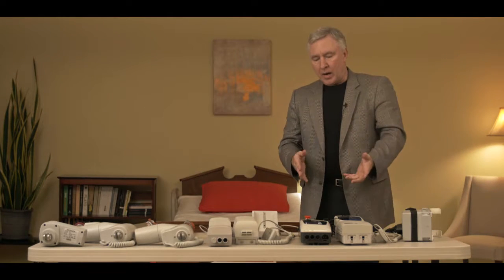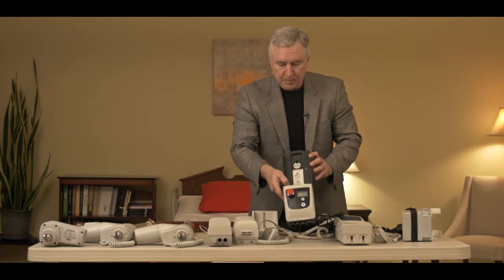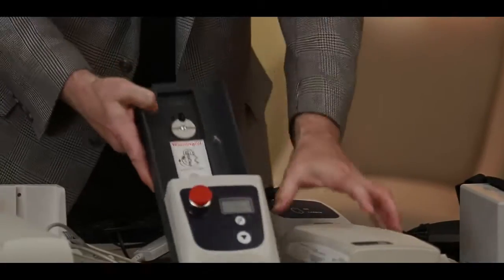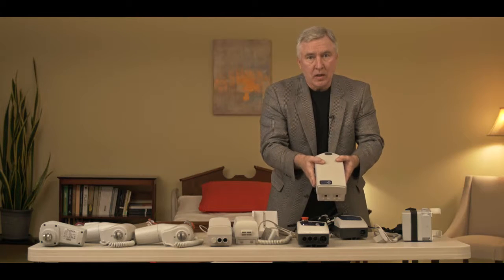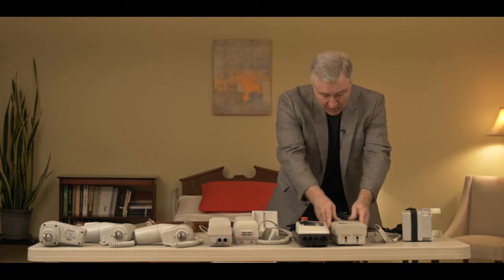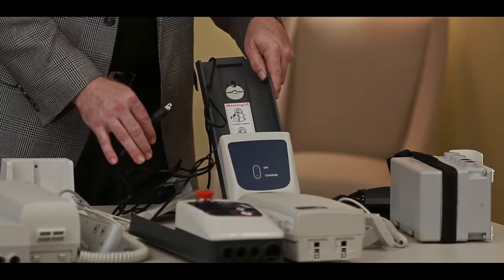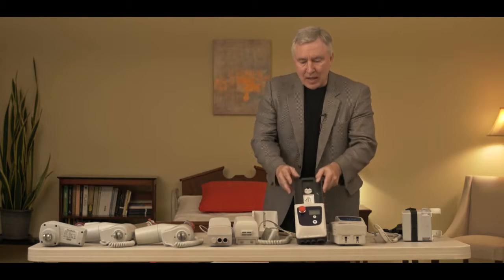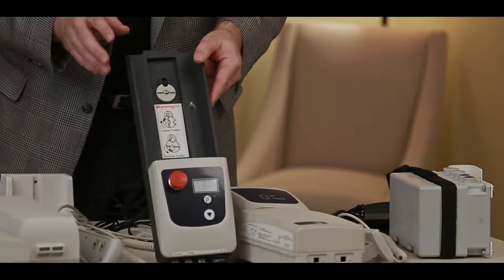The second style of electronics has a little bit different functions on it. The emergency stop button is in the front of the control box, and the battery actually removes from the control box. With this style, you can actually buy a wall-mounted battery charger to charge a separate battery for your patient lift. So you can have two batteries for the patient lift — one charging, one on the lift — and switch them out at any time. The second style has a distinct look to it; that's how you would identify that style.